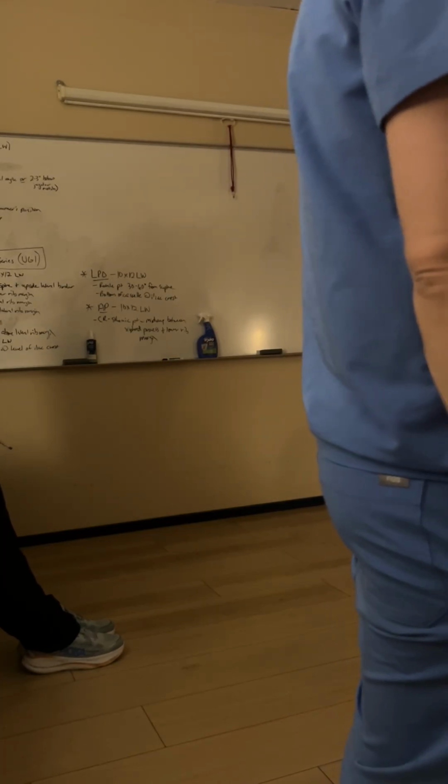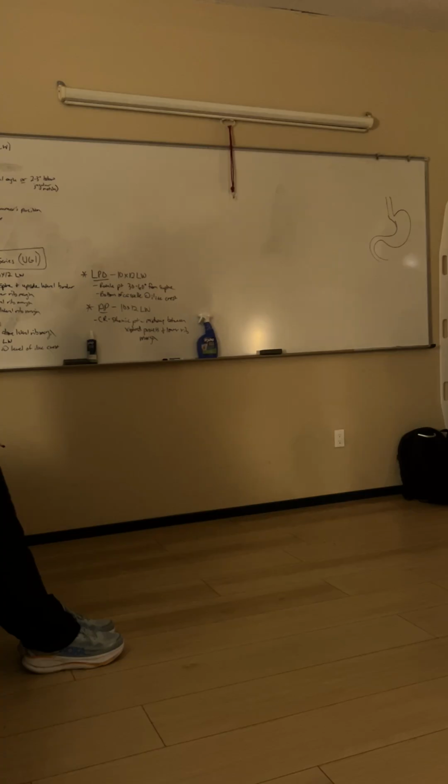Patient communication is the most important with fluoroscopy examination because when we get a regular x-ray, like a wrist x-ray, it is important to know what happened and what's going on. But when we're doing an upper GI, we need to know more information. Honestly, the most important is we need to know if they got a CT earlier with contrast, then we can't do it because there's already contrast in their stomach. So we need to ask a lot of questions when it comes to fluoroscopy. Questions?